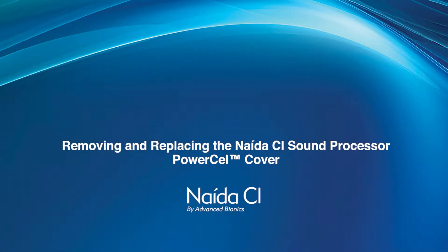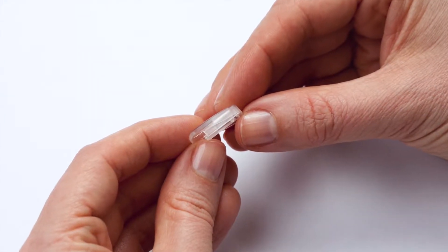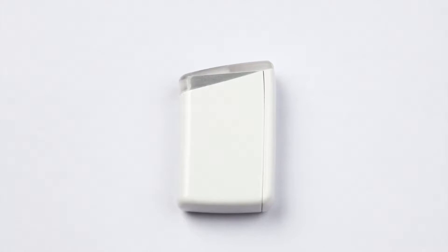Removing and replacing the Naida CI Sound Processor PowerCell Cover. The Naida CI PowerCell cover should be utilized to prevent debris from accumulating on the battery connector.